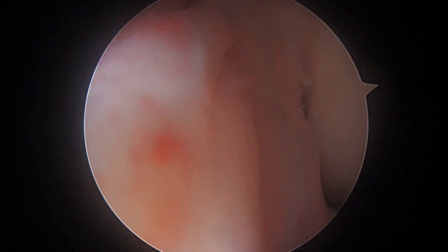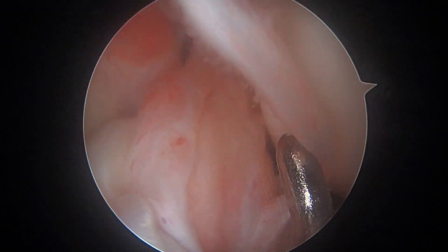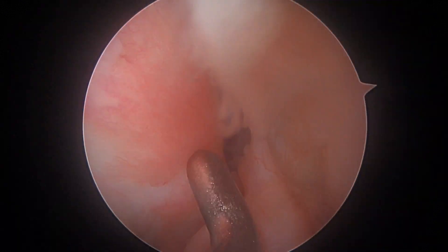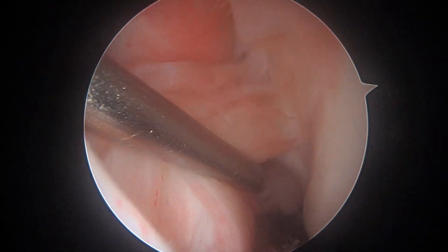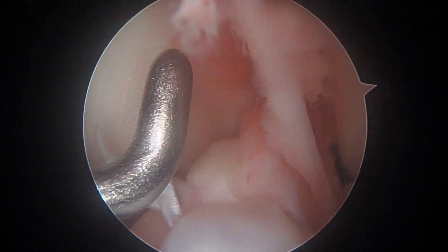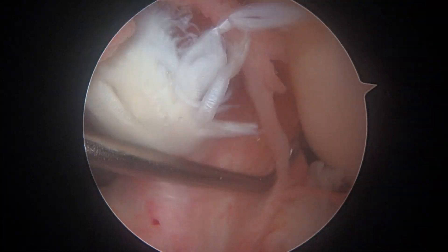We confirmed it was torn before we started the arthroscopy, so we've already harvested. With our probe, we'll show you what a torn ACL looks like here. It's supposed to be right here — this isn't normal, these little torn fibers. It's been a while, so the ACL kind of scars down. At first glance someone might think it's still there, but you have the benefit of your knee exam — your knee was very loose. When we look in and see these torn fibers, we know that that's an ACL tear.